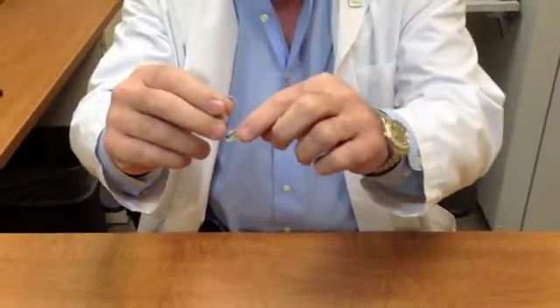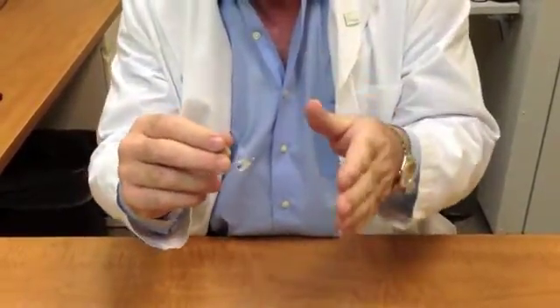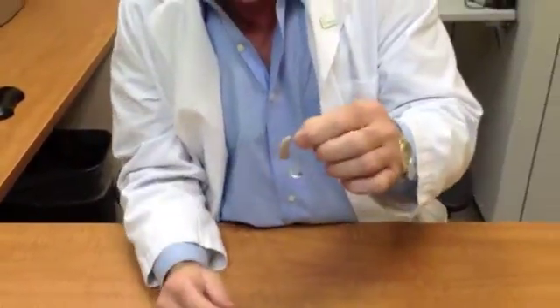What the difference is, is that this little wire comes down here with a speaker and sends the signal directly into your ear. The benefit to this product is if your hearing loss changes over the years, you don't have to replace the hearing aid itself. You can replace this receiver and give more power. That's a real benefit. And it really is a high performance hearing aid that is able to handle a lot of noisy environments. And what I have at the end of this is called a mold. This mold would be custom to your ear canal. That's the best way you can get the performance out of a hearing aid.